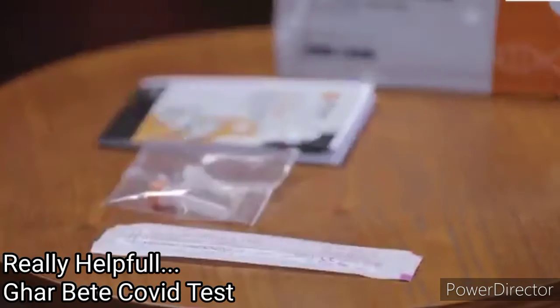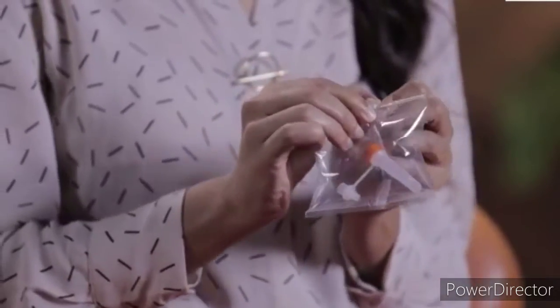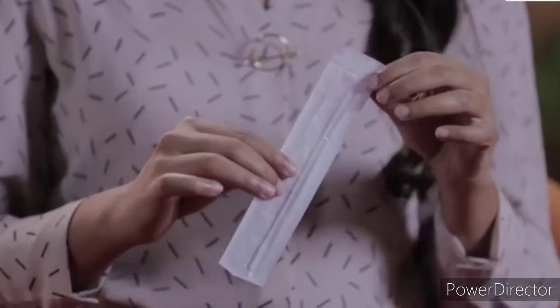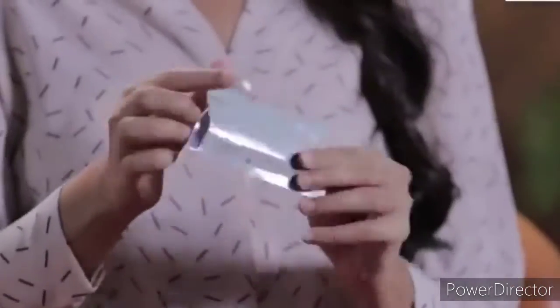Lay the contents of the kit on a table and I will walk you through them one by one. This is the instruction manual. This is a pre-filled extraction tube. This is a sterile nasal swab. It has two sides — one is the plastic side and the other one is the paper side. One test card. This is a biohazard bag.